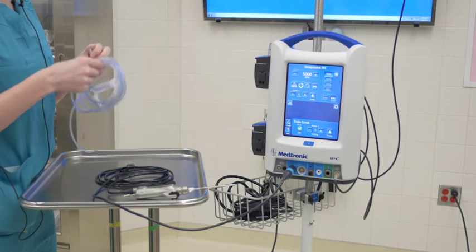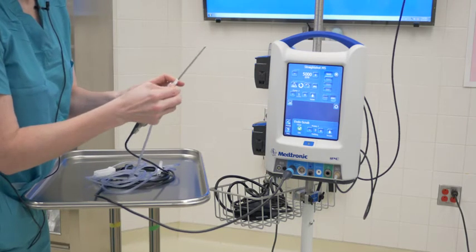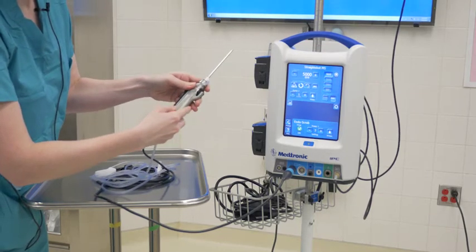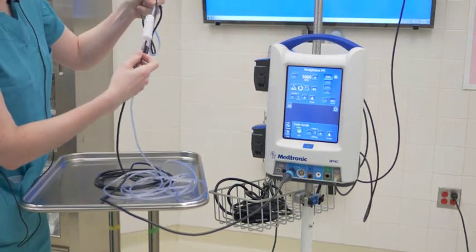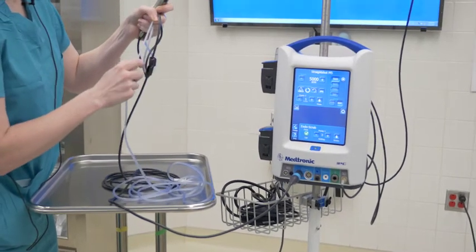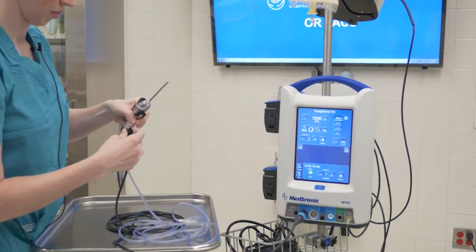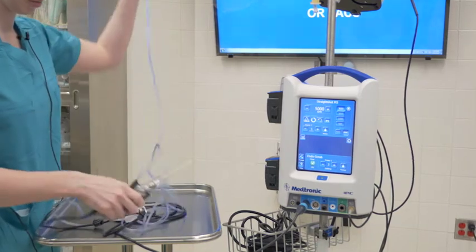And then it comes with tubing. So this plugs in right here, gets pushed into this groove, and then there's clips that hold the tubing together with the cable. And now you're ready to prime.